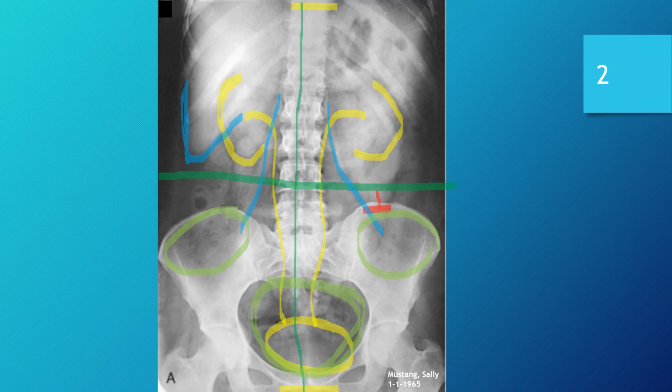Now, as I said, this is not something that we can really do anything about, as bowel gas is present in every patient. But just keep in mind, of course, that if this were a patient that was being scouted for a fluoroscopic procedure, make sure that patient had followed their preparation guidelines correctly, because this is what you want to try to avoid if you're getting into one of those kinds of procedures.